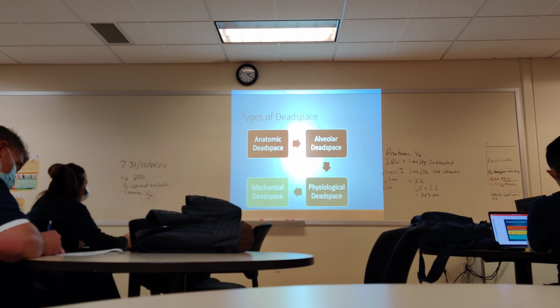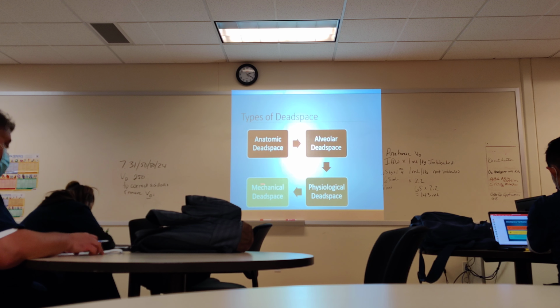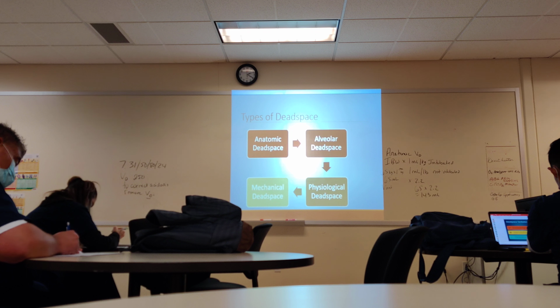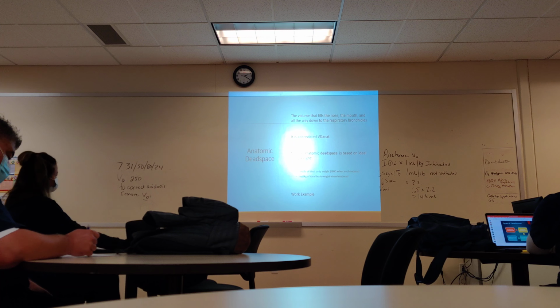So you just told me the four types, and yes, there they are. So mechanical, that's the plastic. That's all of our ventilator circuit. Physiologic is a product of anatomic and alveolar. So our anatomic dead space is based on whether you're intubated or not, and based on your ideal body weight, and the examples are over here.